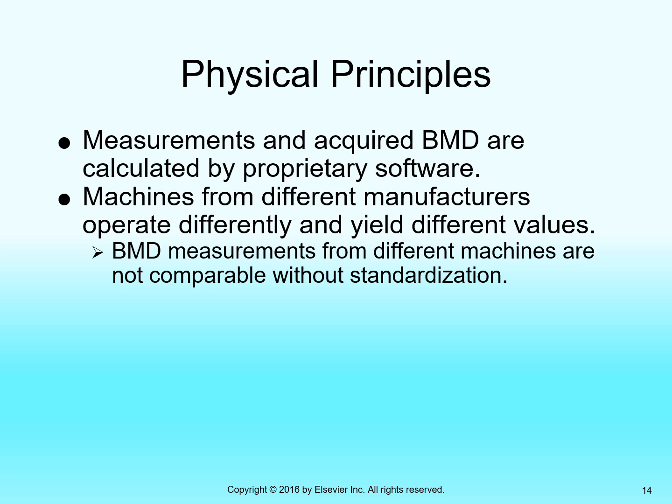And so one of the troubles with bone densitometry as a monitoring mechanism is you have to explain to your patient the importance that when they get the follow-up exams, they get them on the exact same machine, because each machine is calibrated according to that manufacturer. And if they go to a different provider, they might use a different machine made by a different manufacturer and a different method of calculation, and then you don't have comparable results without standardization. So it's a little nuance.